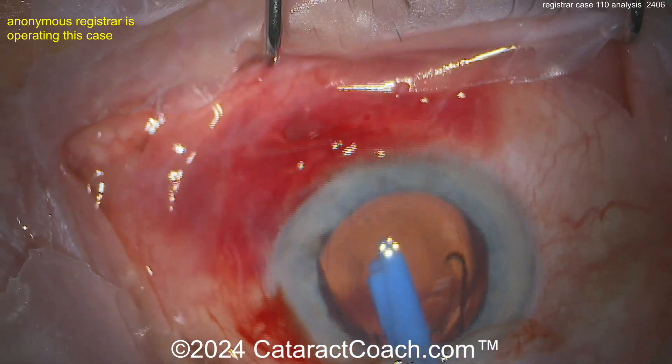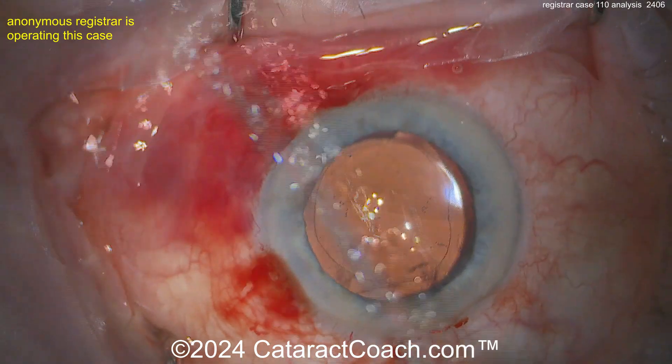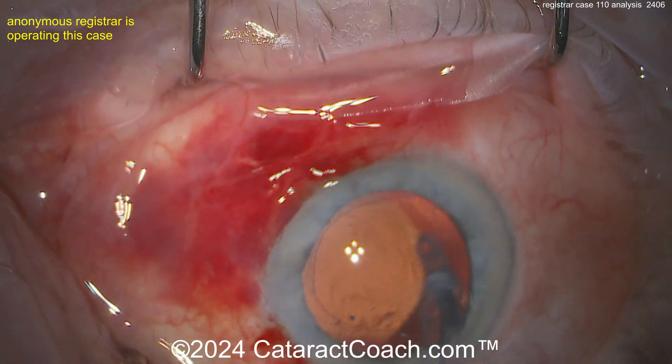Nicely done — here comes that monofocal lens delivered inside the capsular bag. Put the whole thing in with just the injector. Look at the rhexis — it was fantastic. It's a beautiful case; I am impressed.